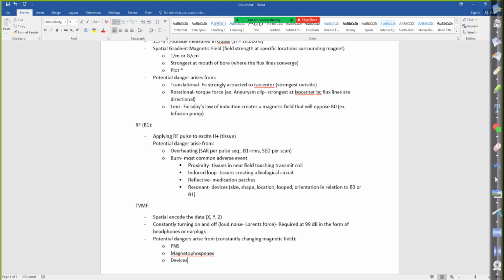It's not really the length of the wire, it's where they end. You're inducing a voltage in those stimulating wires, and wherever it ends, it's going to deposit all that heat and burn that part of the brain. So think of devices with an electrical component, like deep brain stimulators.